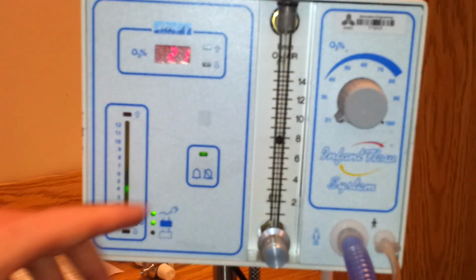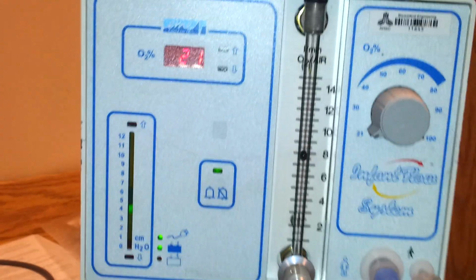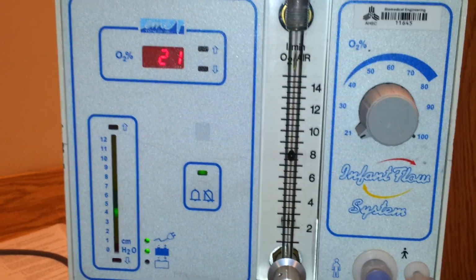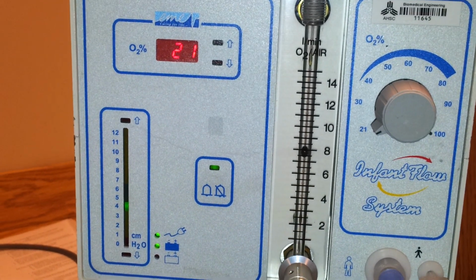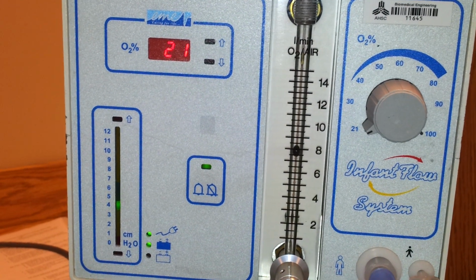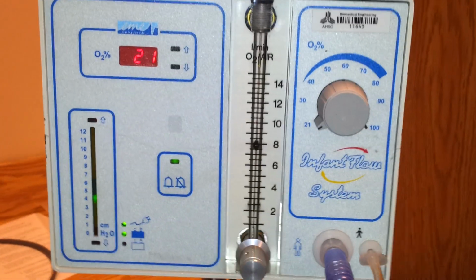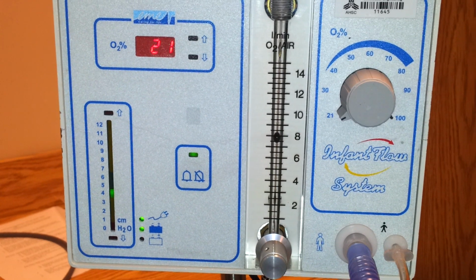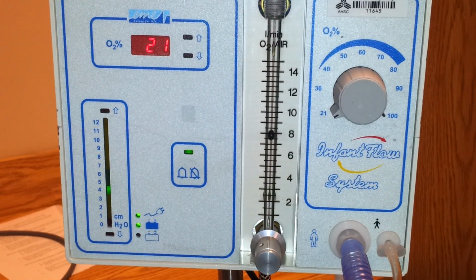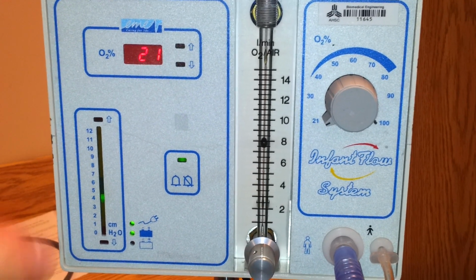If you have it at 8 and you're not getting 4 to 5, if it's much lower, you should look for a leak. There's most likely a leak. You don't want to turn the pressure up. So you should always test it before you hook it up to the baby. So block off the end and make sure it's reading 4 to 5. If you hook it up right away and you're not getting that, you know there's most likely something wrong at the other end and it's not the circuit that's leaking.